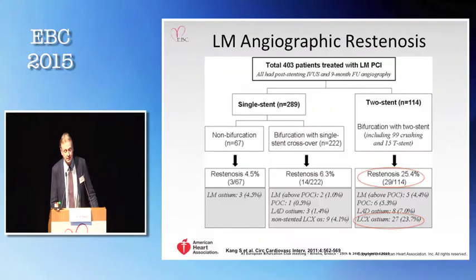And then we started a couple of years ago, or maybe a bit more, because now we also have a 2-year follow-up. We started to try to exchange this one drug-eluting stent which goes to the ostium of the circ with a scaffold.